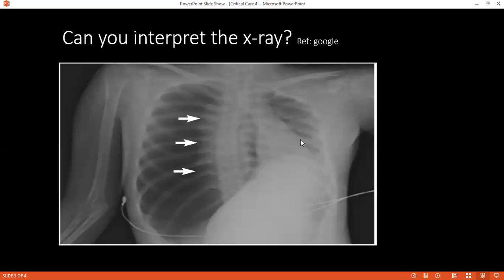What about the lung? Do you see it collapsed? The lung on the left side is actually collapsed. There's reduced lung tissue, reduced to only the upper part. Is there any effusion you could see? It's difficult to say because of the position of the heart. But the cardiophrenic and costophrenic angles are obliterated. I can't see them, otherwise you would be able to appreciate it. Okay, good. Thank you.